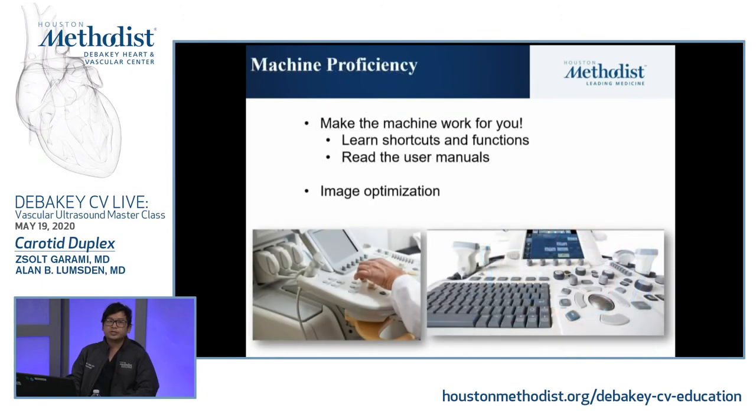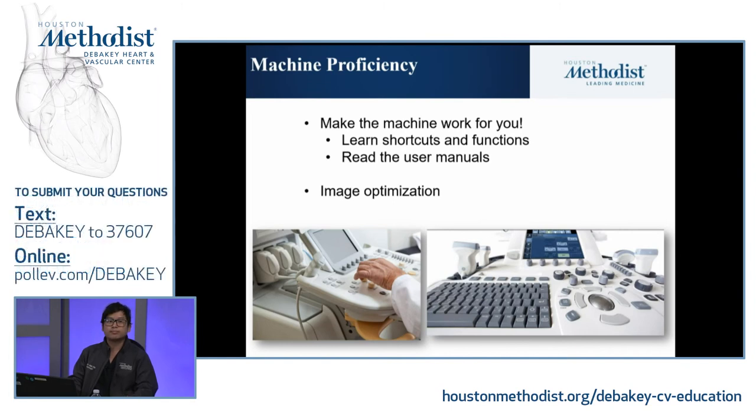Machine proficiency: make sure you're making the machine work for you. If you don't have time to use the user manual or read it, then definitely consult with your apps specialist and see if they can make adjustments to your protocol or your system overall to make sure you're as efficient as possible. Because of course, the more proficient you are, the more efficient you are. And you also want to be sure your image optimization is on point. You can't do diagnostics without having a beautiful image.